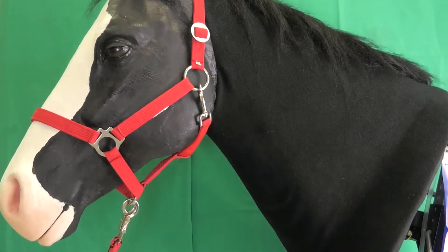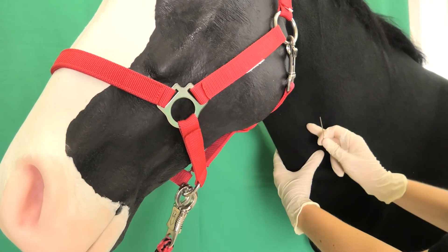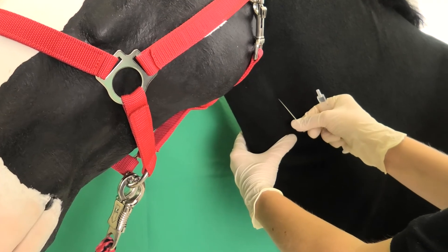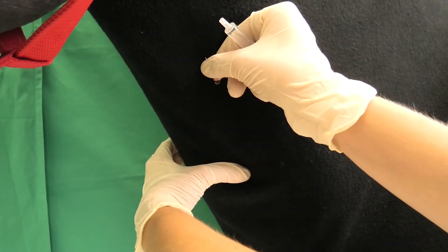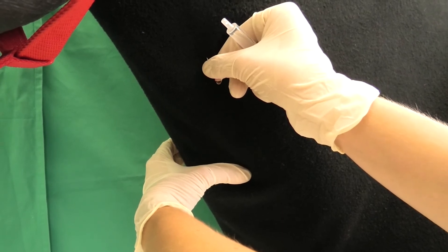Stand on the left side of the horse to inject into the left jugular vein. Right-handed people would use their left hand thumb to congest the vein towards the heart. The right hand inserts the cannula into the congested vein at a 45 degree angle to the vein, in direction of the head. The bevel of the cannula should point away from the animal. If the vein has been punctured, blood will leak out of the cone. The hand holding the cannula should always be in contact with the animal.